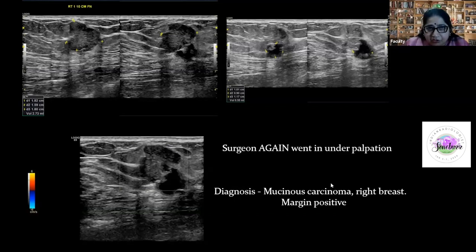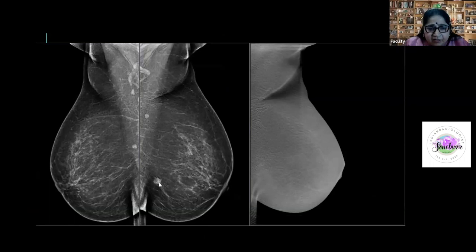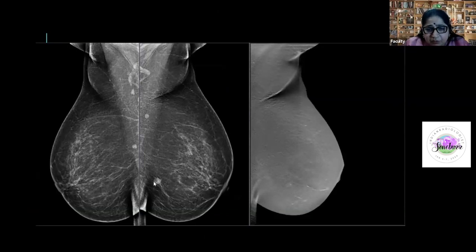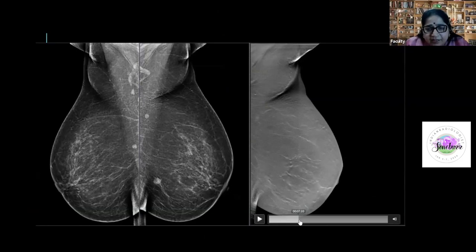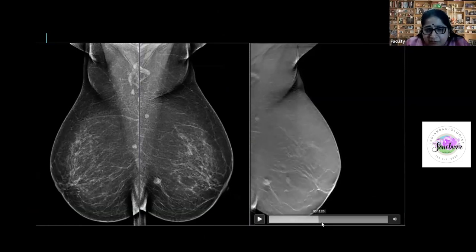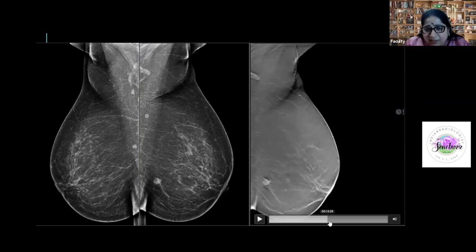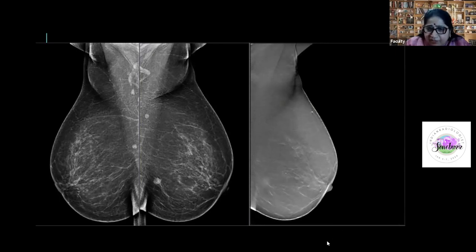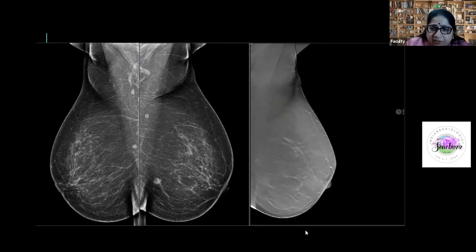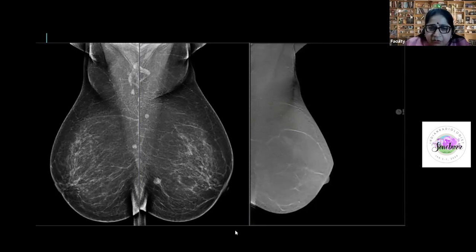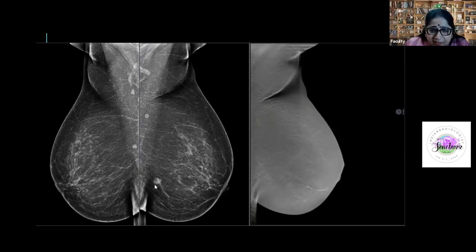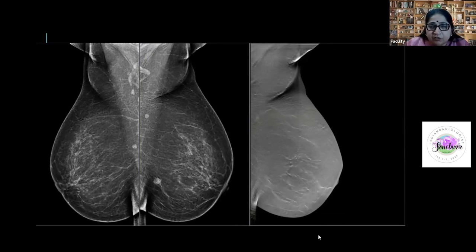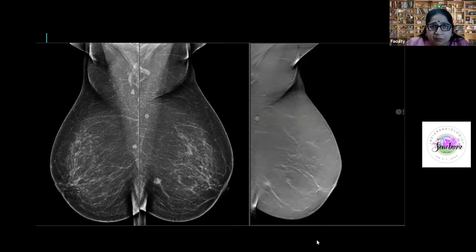Not everything that looks reniform with a fatty hilum in the breast is an intramammary node. I called a new mass BI-RADS 3 because of its reniform shape, central lucency, and a strand I thought might be a vessel. MRI also reported it as T2-bright and benign. However, it grew and was proven to be a mucinous carcinoma. New masses must be treated with concern even if they look very benign.